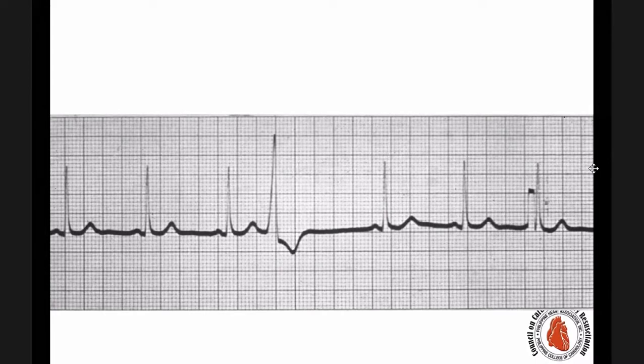And it's a wide complex QRS because the electrical impulse is traveling through muscle to muscle. And if you look at the T wave, it's opposite from the QRS complex, pababa siya. Unlike in a normal beat, the T wave is upright. Ito, the T wave is inverted or opposite to the QRS complex.